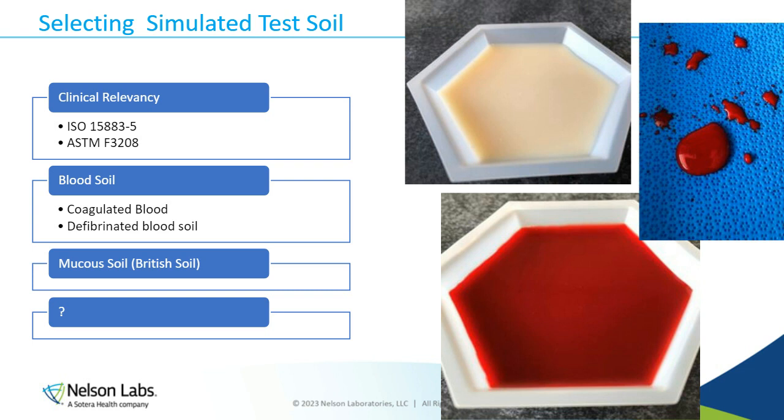Understanding is important, because we have seen validations come back, especially dental. You would think that dental devices are simple, easy, a little bit of blood here, we're good to go. But because they're going in the teeth, they want to see bone added to the test soil and being challenged. So some of the things that we have not done previously or even thought about, we now have to think about. And engineers have to, because we don't know the device, we don't know how it's used. We're looking for recommendations from the manufacturer to understand, how is this being contaminated?